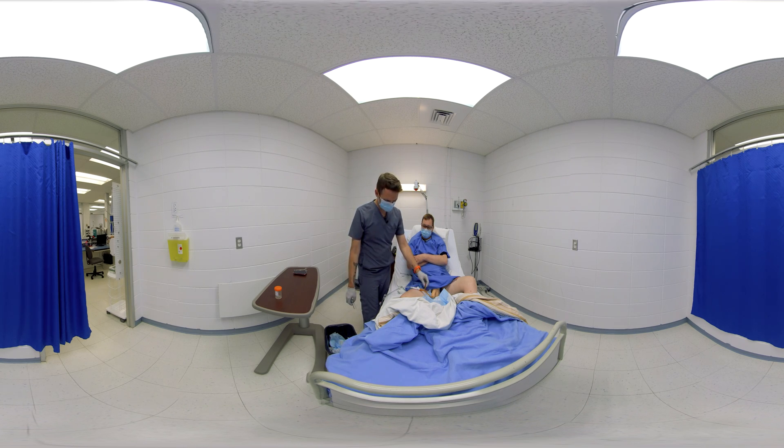The nurse makes sure the amount of liquid collected in the syringe corresponds to the amount needed to inflate the balloon. Again, this is done to prevent any potential injury during the removal procedure.